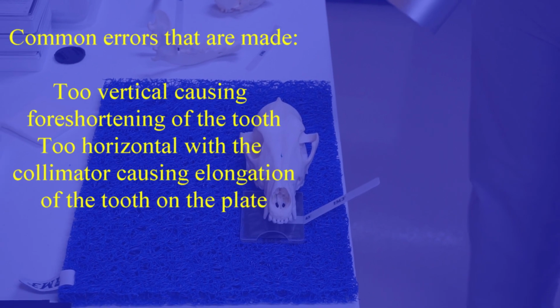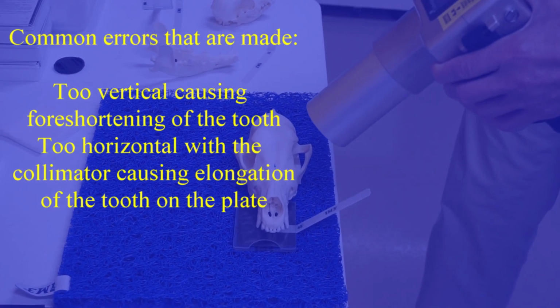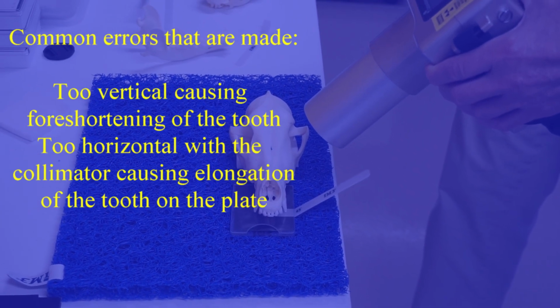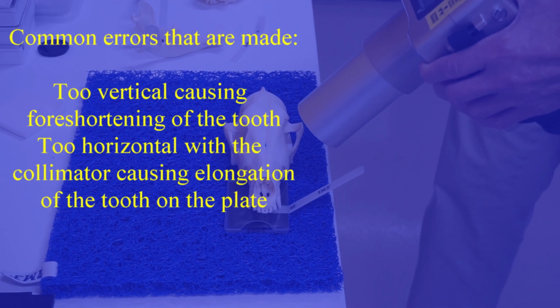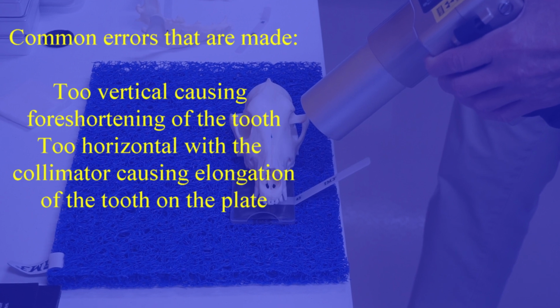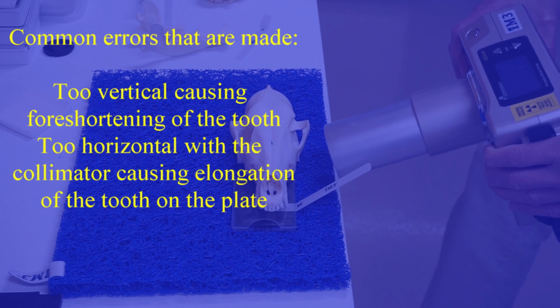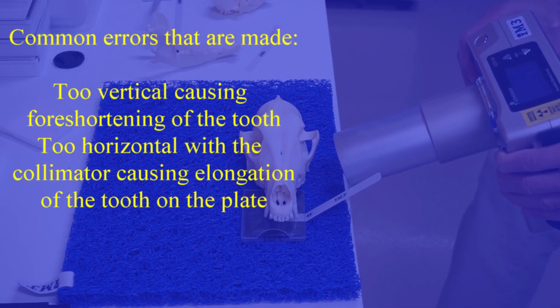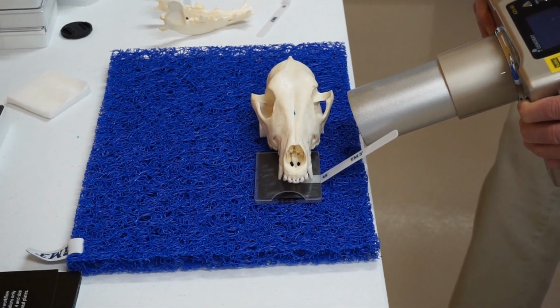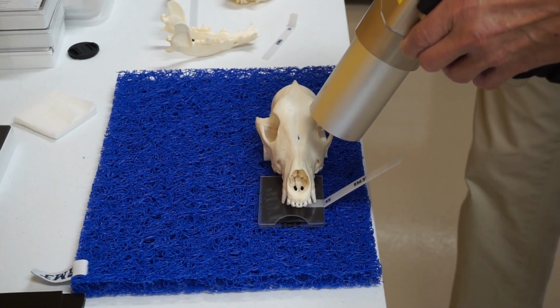So the errors that you can make is that you are too vertical. If you're too vertical, you'll be foreshortening the image, so you won't have the true bisected angle, so your tooth image on the plate will be shorter than normal. If you're too horizontal, your image will be elongated, so the image of the tooth on the plate will be elongated. So too horizontal means you have an elongated image, too vertical means you've got a foreshortened image.